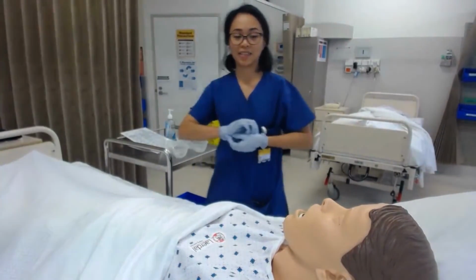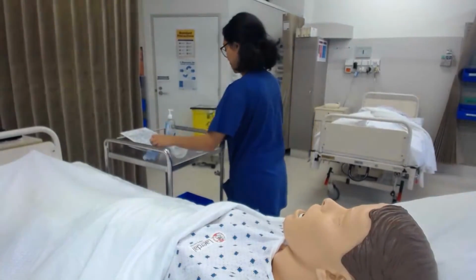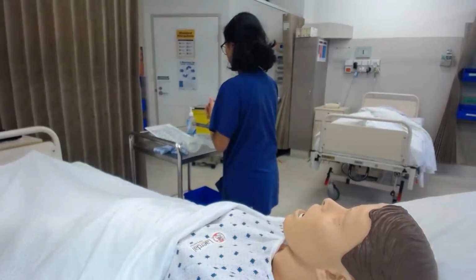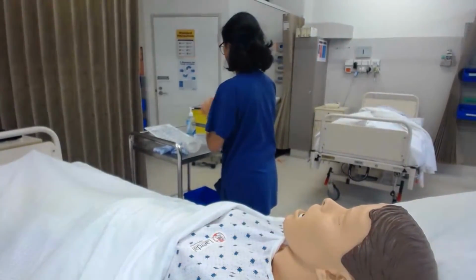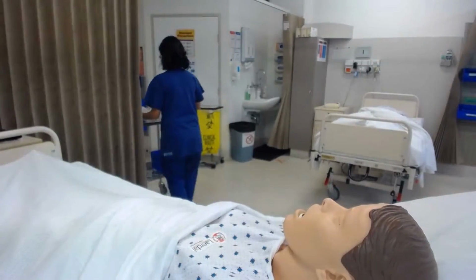Conclude the interaction with the patient. Leave them comfortable and reassured. Perform hand hygiene. Dispose of all equipment and rubbish. All sharps must be disposed of in the sharps container. Complete the accurate documentation.